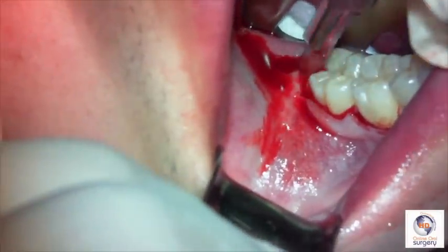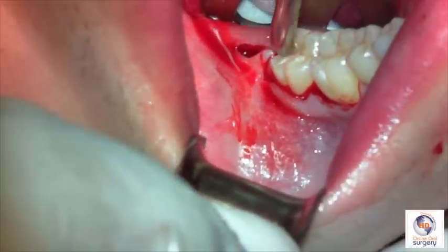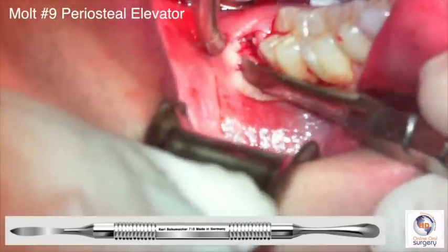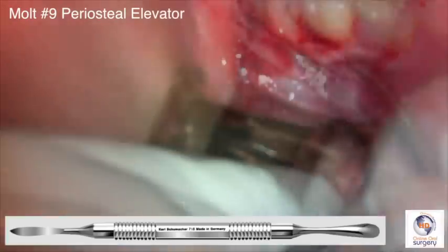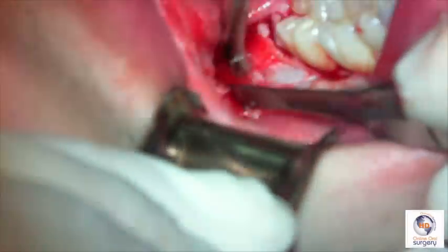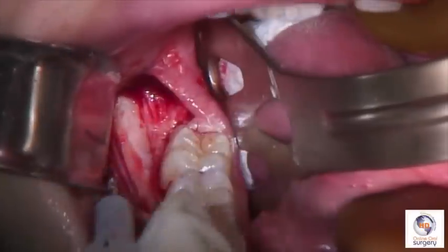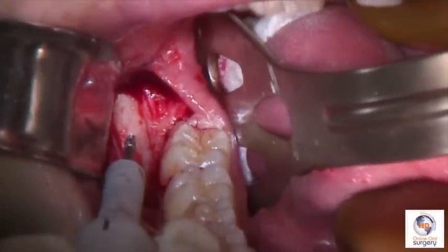It's important to use a sharp blade as the tissue is quite thick, and to carry it all the way down to bone. If I'm doing a bilateral case, I'll use a fresh blade for each side. Next, we're going to do a full thickness mucoperiosteal flap with a molt periosteal elevator. It's important that the sharp end of the molt periosteal be used and go all the way down to bone, so that you are getting underneath the periosteal layer and reflecting it as atraumatically as possible. Once we've fully reflected that full thickness mucoperiosteal flap, we then need to get access to the tooth by removing the next layer, which is the bone.